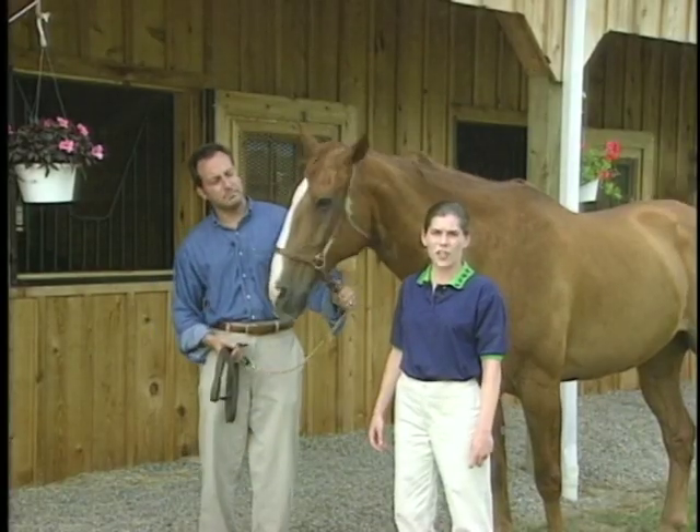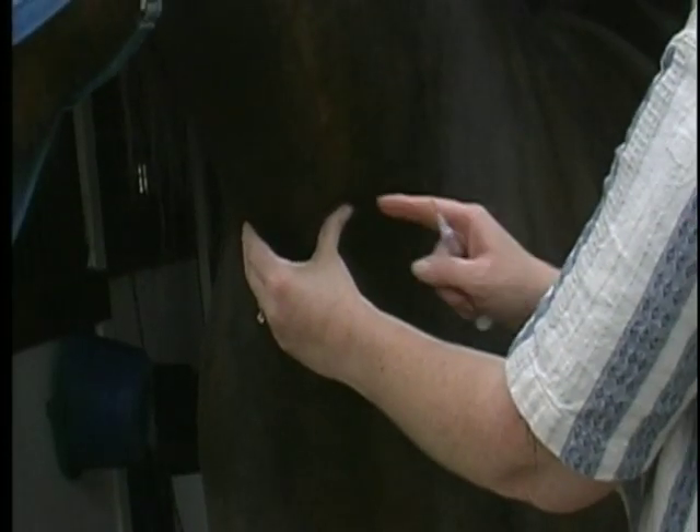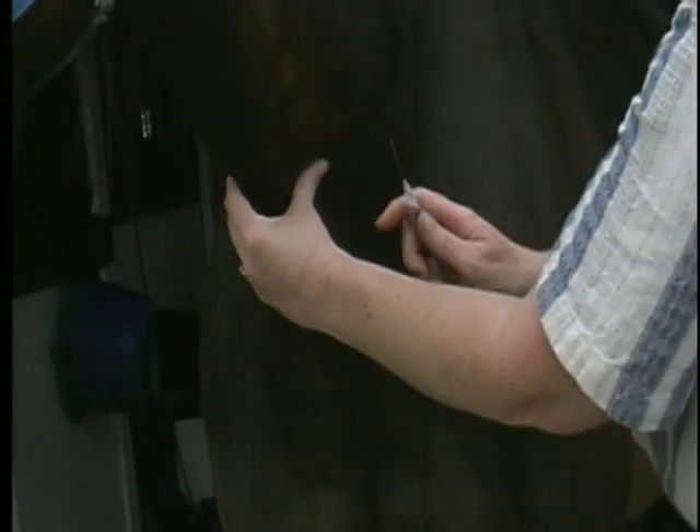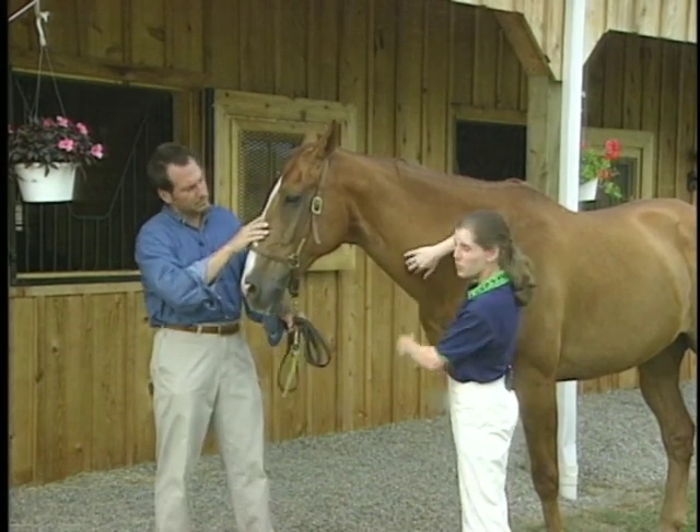The large vein of the neck, the jugular vein, is used for injections. This is located in the deep groove between the muscle bellies of the neck. Here are the two large muscle bellies, so it's located right in this groove here.